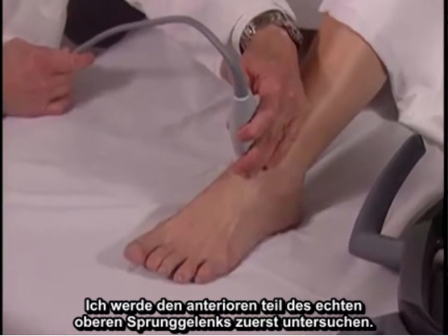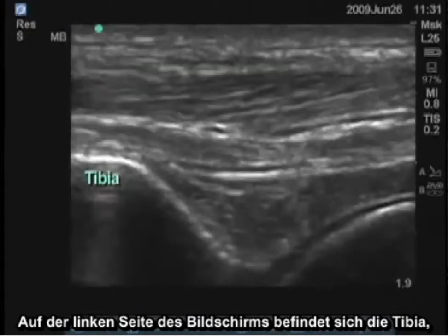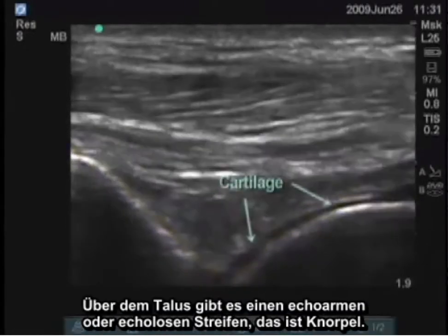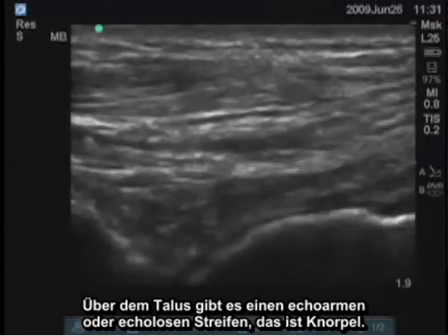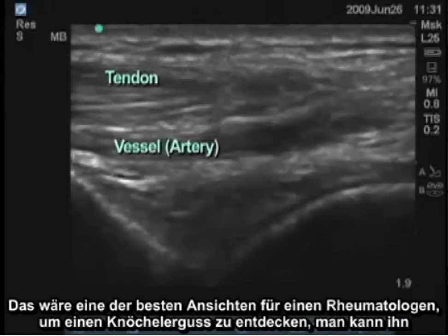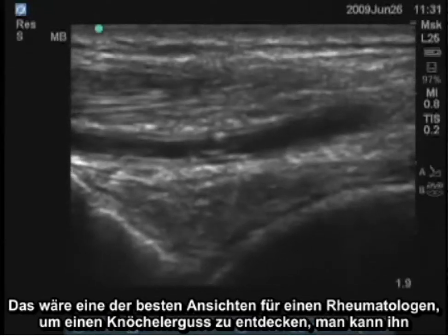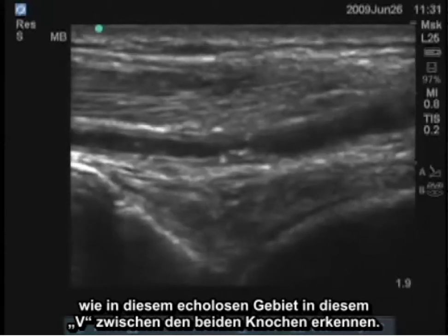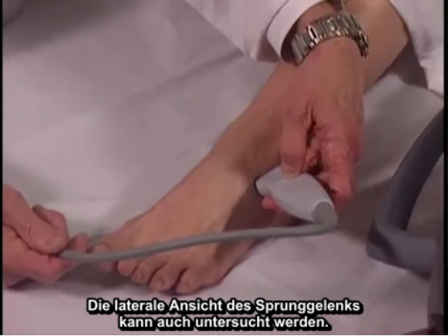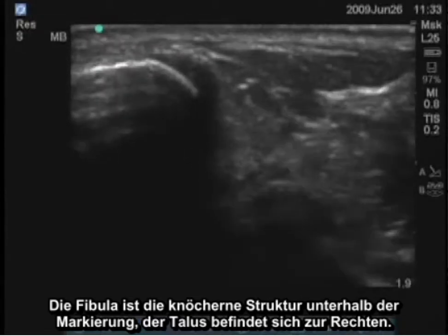I'll examine the anterior portion of the true ankle joint first. On the left side of the screen is the tibia, and in this view you see the tibiotalar joint. There's a hypoechoic or anechoic stripe over the talus, which is cartilage. There are also vessels and tendons superficially. This is one of the best views for a rheumatologist to find an ankle effusion, seen as an anechoic area in the V between the two bones.